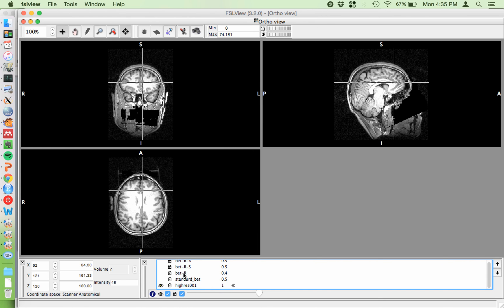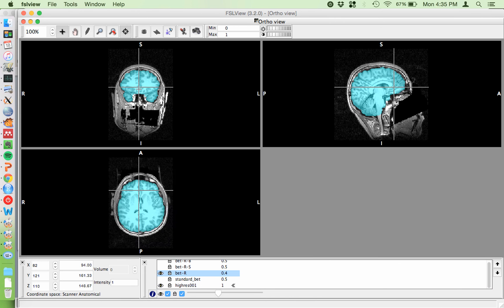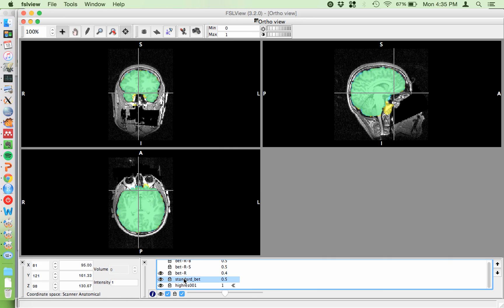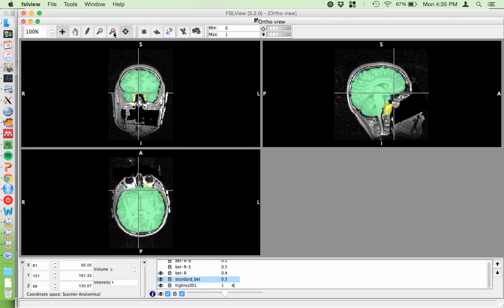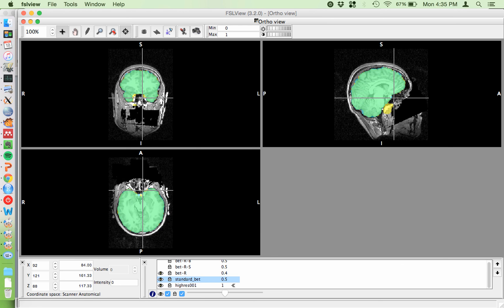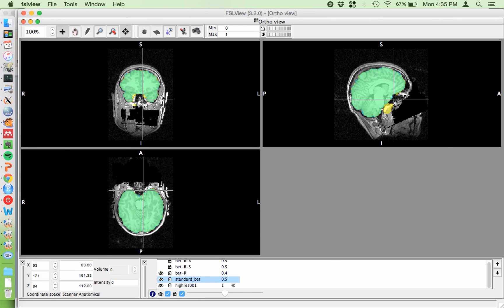On the next one, I use BET with the minus R flag — the robust center estimation. It's blue just because I made it blue. Putting the original underneath it, I'll zoom in using the magnifying glass. You can see it's doing a little bit better — it's getting less of the non-brain tissue than the standard BET was. Otherwise it's about the same, with a bit less here too.